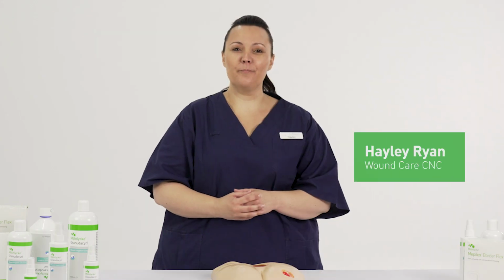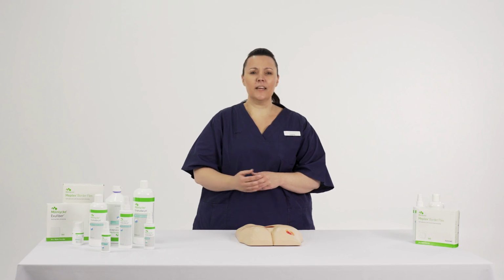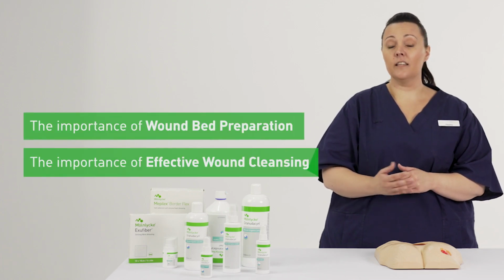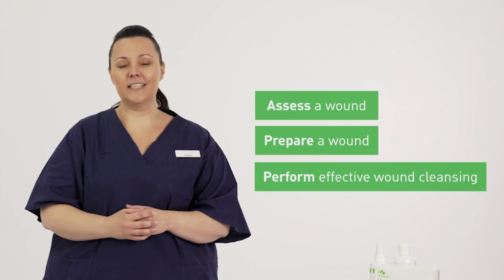Welcome to the wound bed preparation and wound cleansing in practice video. Through recent advances in science, we have an improved understanding of wound healing, the importance of wound bed preparation, and the role effective wound cleansing plays in the healing process. In this video, we will demonstrate how to effectively assess a wound, prepare, and perform effective wound cleansing.